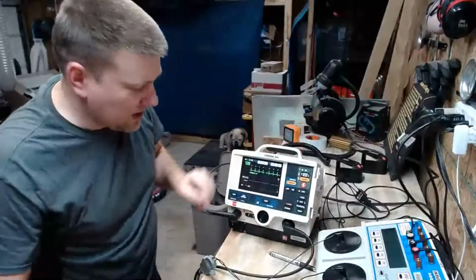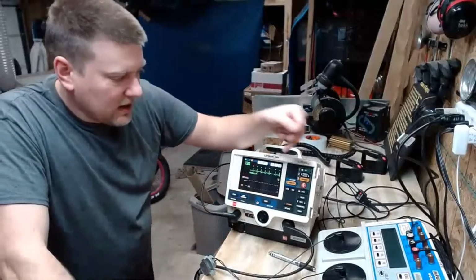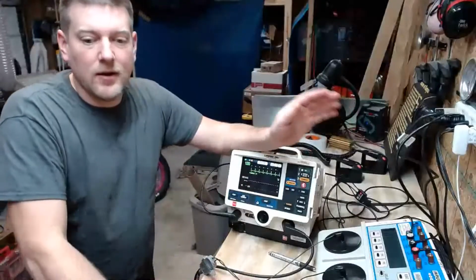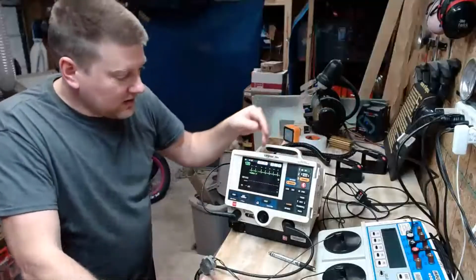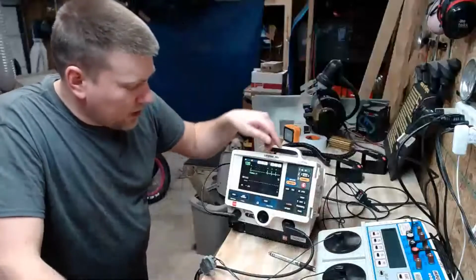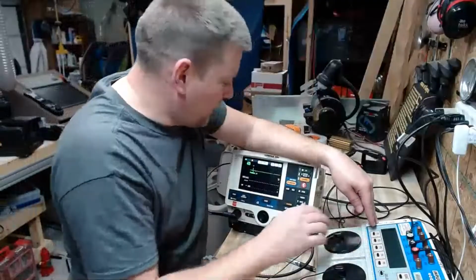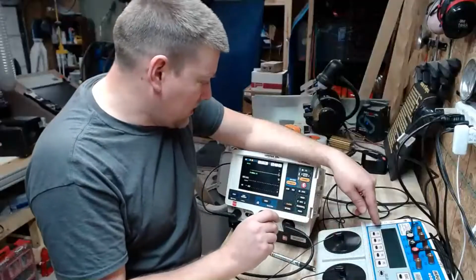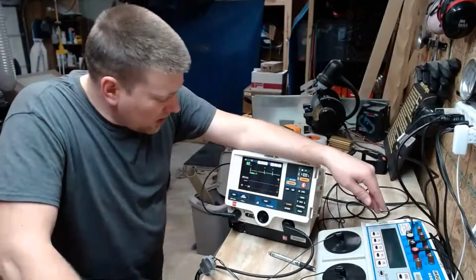Let's see if I can get it on camera a little bit better. So what it's doing is it's monitoring for the peak. And when it senses the peak, it's going to discharge energy as soon as it can after the peak. And sometimes, I mean, given like right now, it's not very difficult. But when it's on, let's say, an arrhythmia, like atrial flutter. Yeah, it's a little more reasonable.